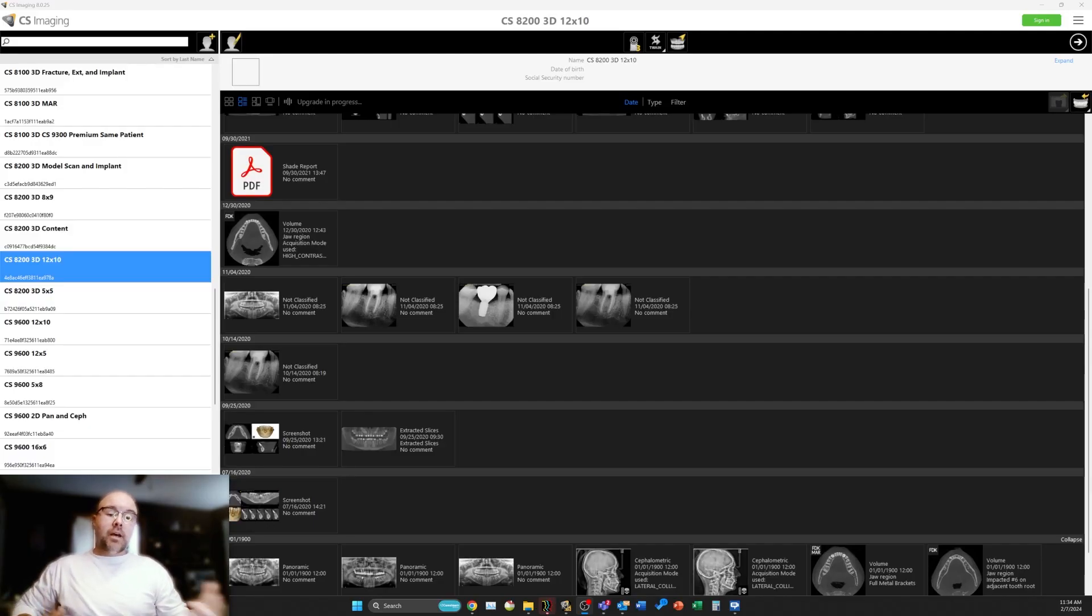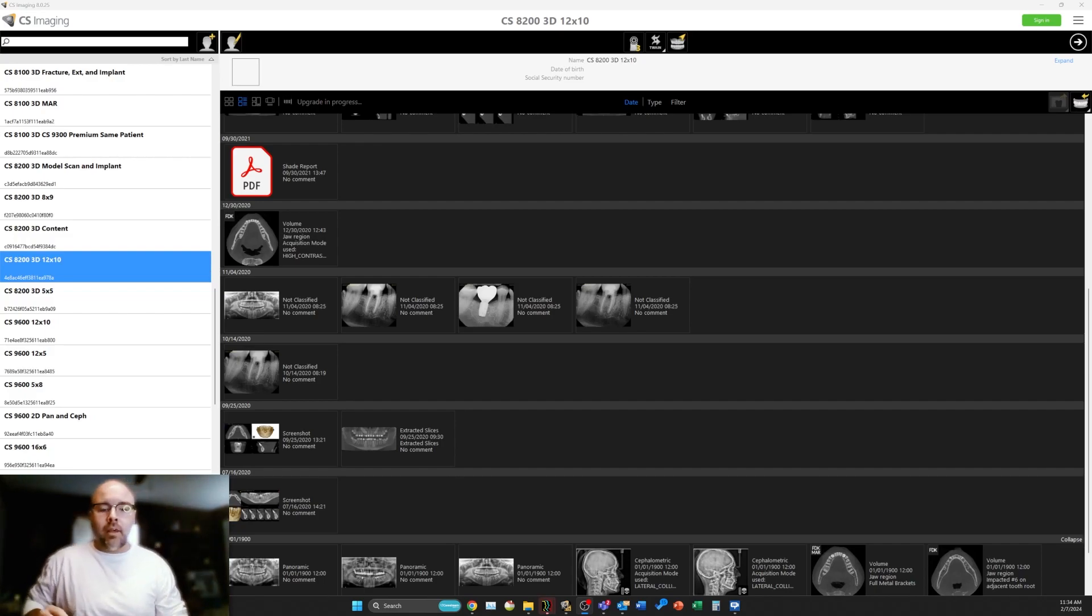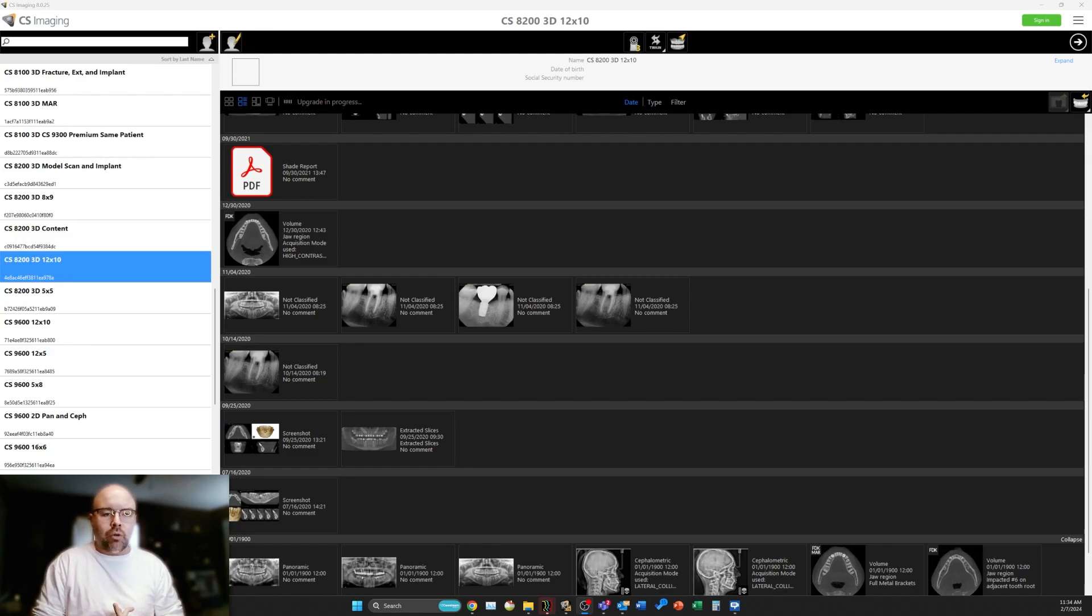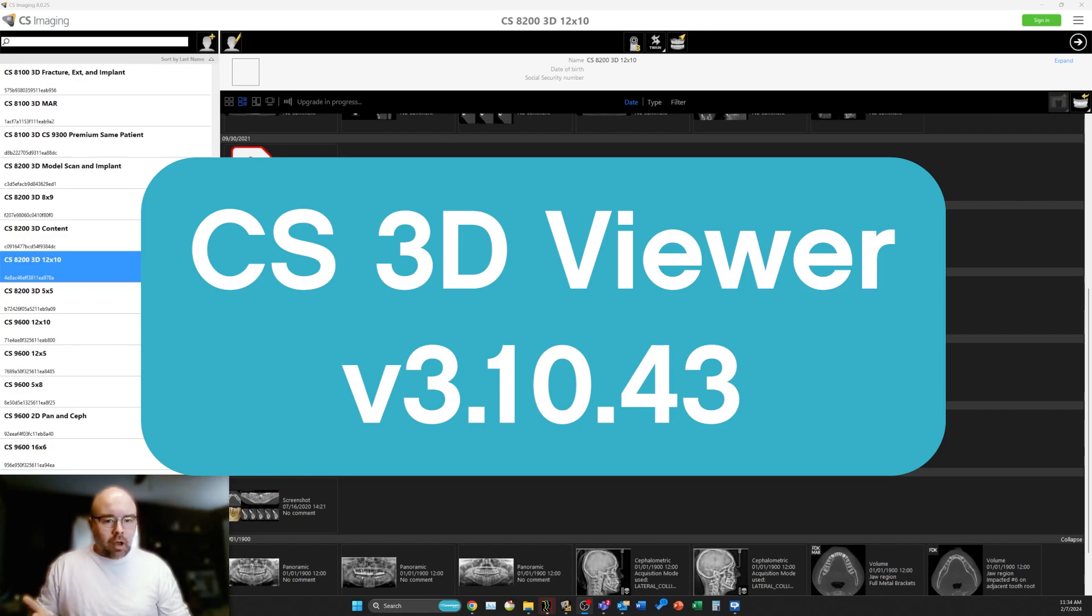Hey everybody, this is Dan from Carestream Dental and I've got something new and exciting to show you. That's the new version of the CS3D viewing software, version 3.10.43.